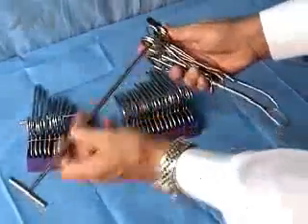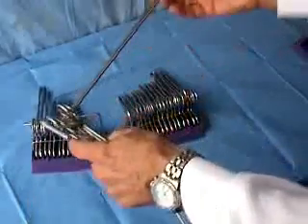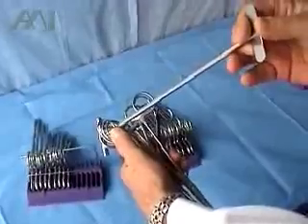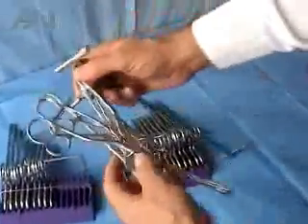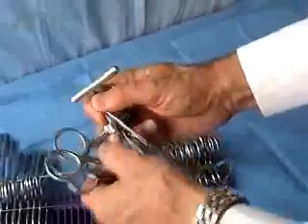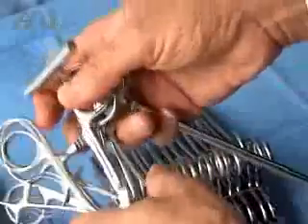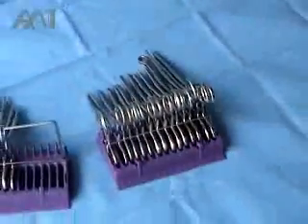Another stringer that is commonly used is this stainless steel stringer that goes through one side of the instrument rings, while the other side is open. You can see the instruments get tangled up and messed up, and they cannot stay in the open position. They may lock accidentally with some pressure, rendering the instrument non-sterile.